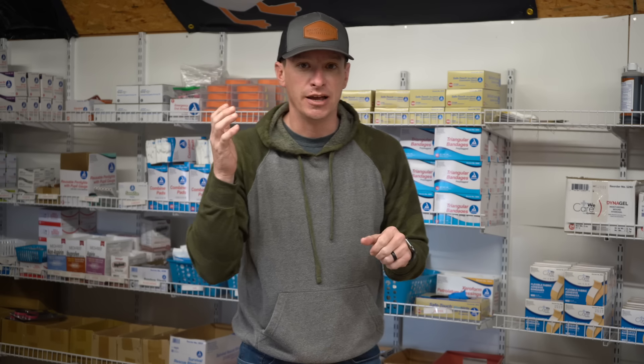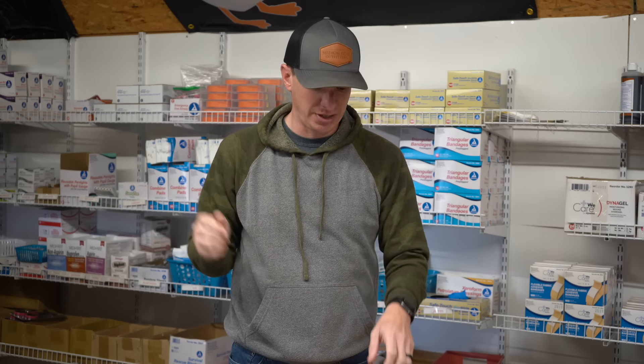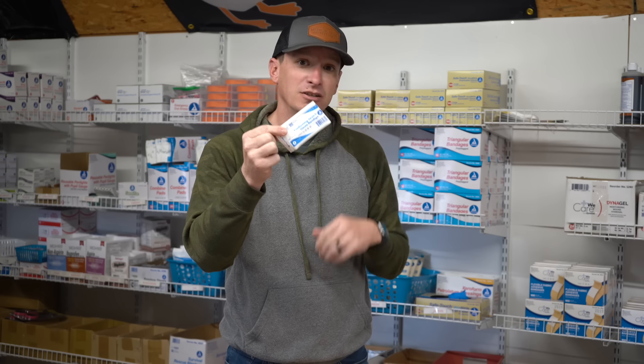The next thing I want to look at is gauze. You're going to need plenty of gauze in this kit. We can go from a wide range of 5x9s and rolled gauze with no hemostatic agents all the way over to hemostatic agents such as combat gauze and QuikClot. If you're on a budget, stay with just regular gauze that has no hemostatic agents. But if budget is not an issue, combat gauze is a better choice.